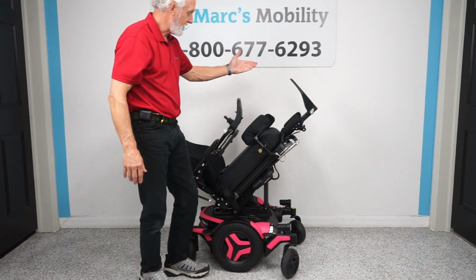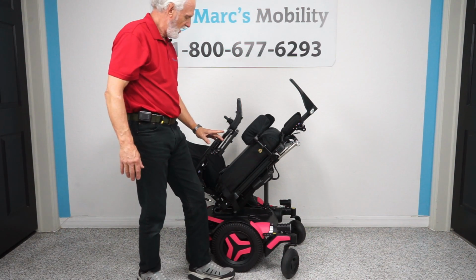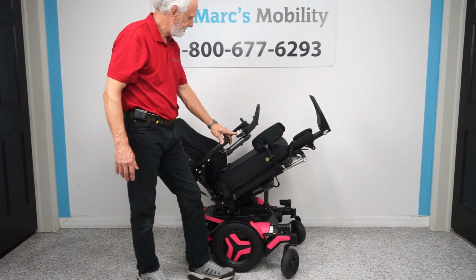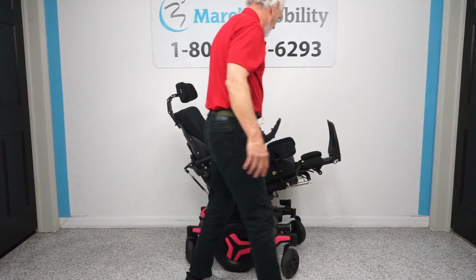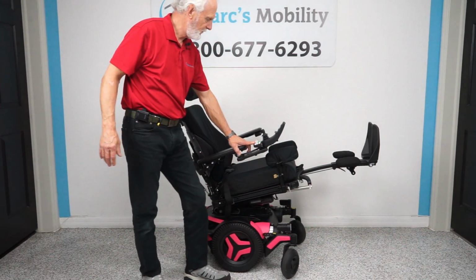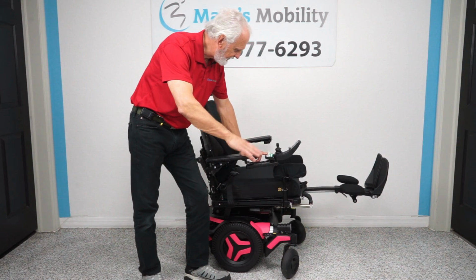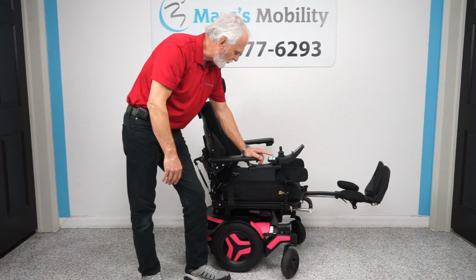So you can see right there, of course this would stay up if your feet were in there. But if you're halfway tilted, let me just bring the seat halfway down. Even right here, you're still tilted quite a bit. You can see where your feet would still be higher than your body, okay? So we've done the seat lift, we've done the anterior tilt, we've done the legs, and we've done the tilt backward. Now the only one left is the recline.